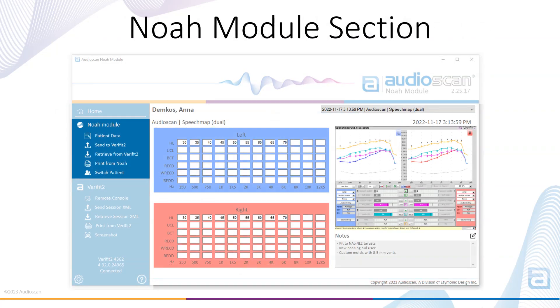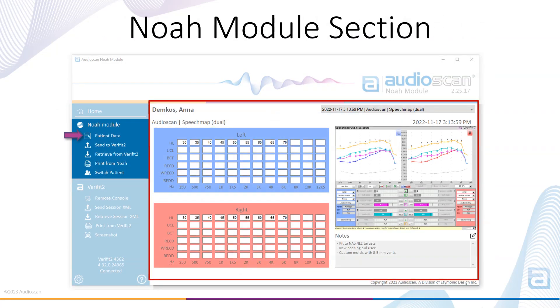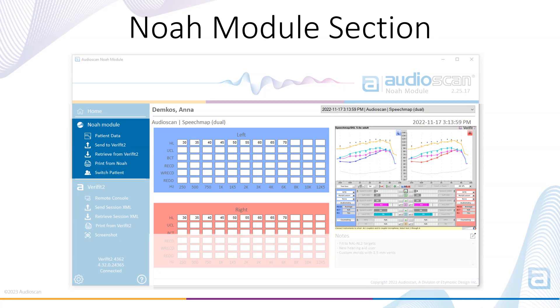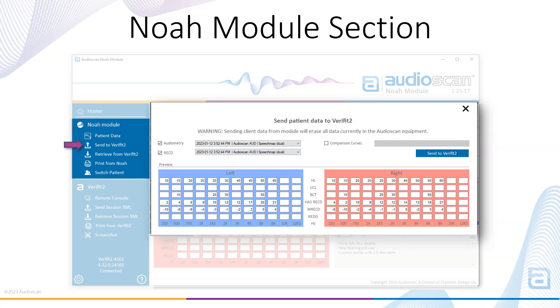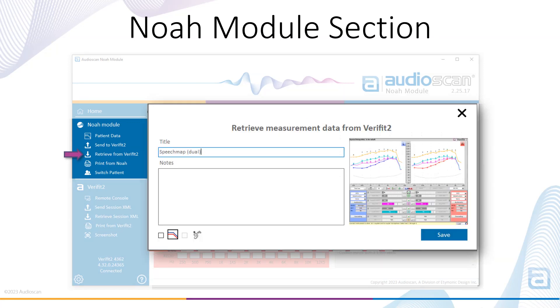The NOAA module section is where you can view and select patient data. Select Send to Verifit 2 to send data to your AudioScan equipment from the AudioScan NOAA module. This can be audiogram data, RECD data, as well as previous measurement results as comparison curves. Note that the AudioScan equipment name will appear in this menu and subsequent menus, according to the equipment you're connected to.